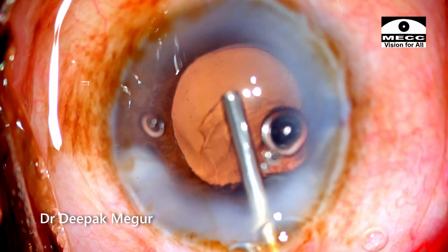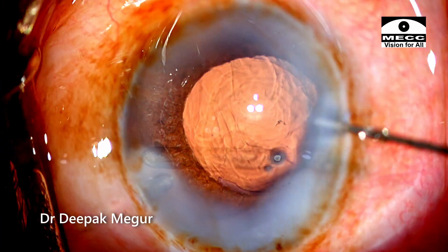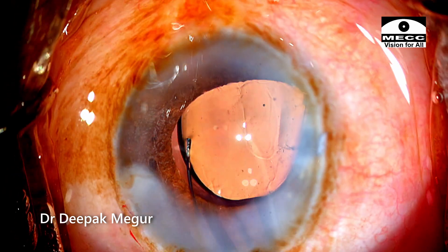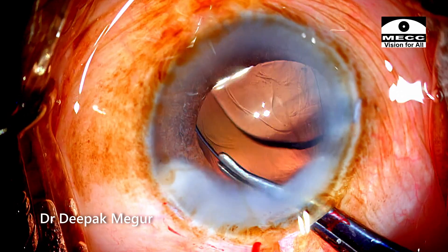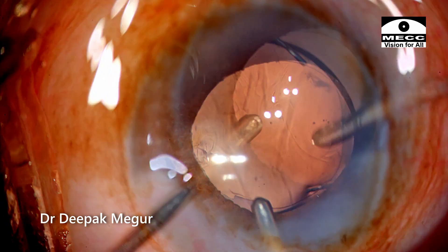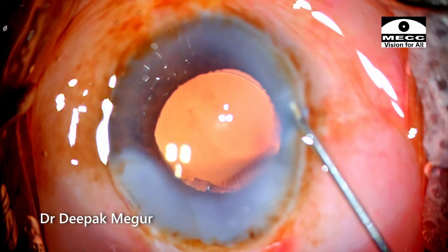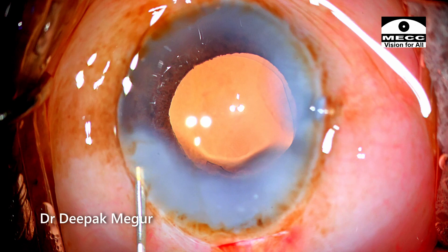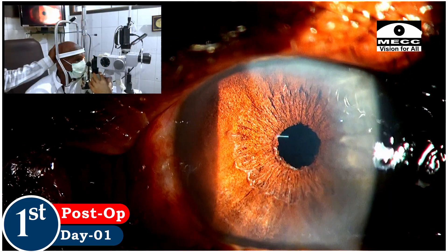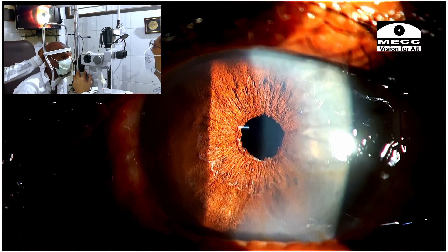Once the nucleus is done, the rest of the procedure is extremely easy. The cortex is aspirated out and the lens is implanted into the bag. Looking at the first-day picture, the patient has an excellent visual outcome. The cornea is very clear, especially compared to the density of the nucleus and the time it took to emulsify it.